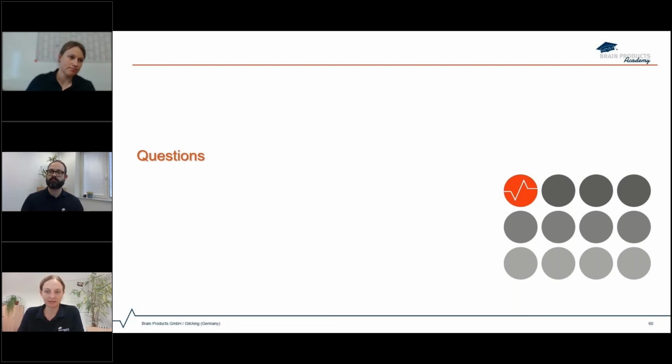Okay, great, thank you. And then one question for Michael about the LORETA transformation. There's a LORETA view in Brain Vision Analyzer. So why would we use regions of interest or defined regions of interest when using LORETA? So I think this is perhaps the difference between the view and the transformation. Yeah, sounds like.